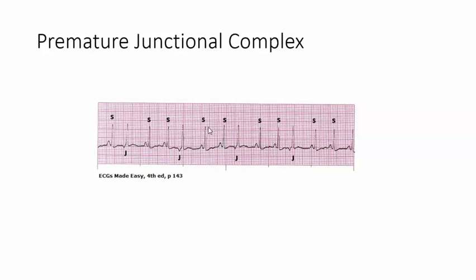Now, take your calipers and go from S to S. We're going to look at the rhythm. I counted 12 small squares, so that gives us a rate of 125 beats per minute — so we're looking at a sinus tachycardia. This beat should have occurred here, this one should have occurred here, here, and here. So you can see the beats are happening early. We have an inverted P occurring before the beat should have happened.